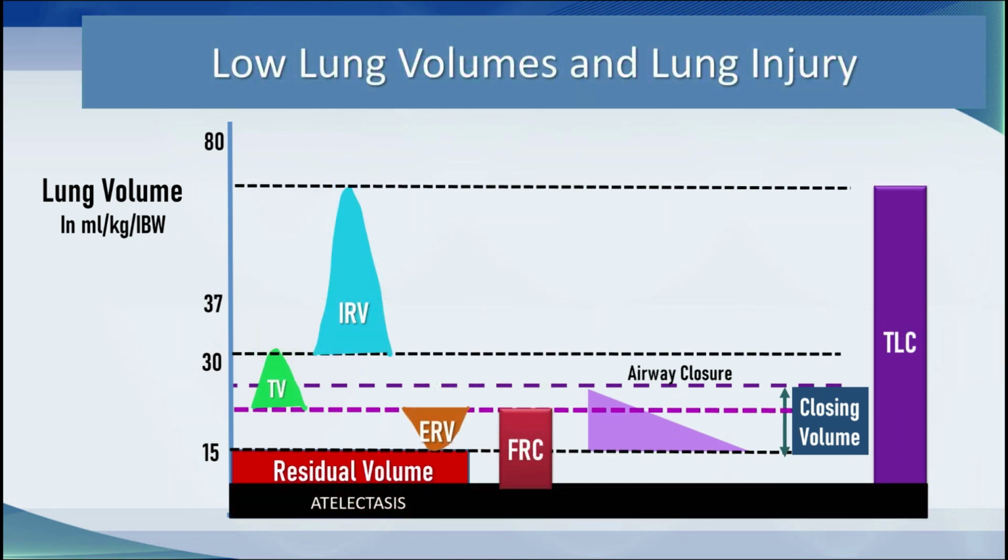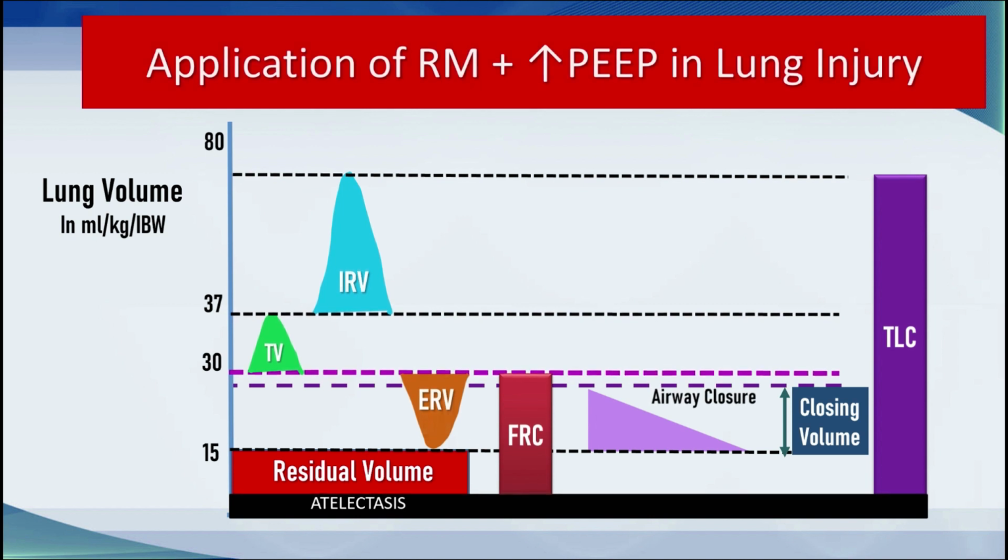This is the situation with our patient Trish, and it's different and more difficult. This is the patient with injured lungs who is struggling to maintain a saturation of more than 90%. Note that there is significantly more atelectasis than under anesthesia, and these lungs are inflamed and soggy. We're going to do a recruitment maneuver and apply PEEP or increase the PEEP, and let's see what happens. You will immediately notice that some of the atelectasis has been recruited, but not all.